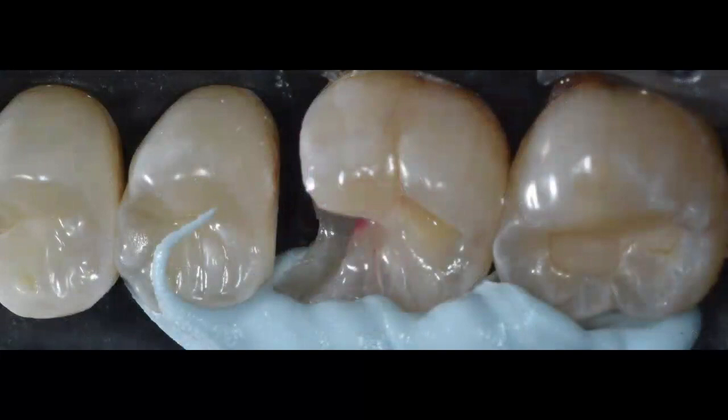I also identify where my peripheral seal zone is and how much decay I need to remove from that peripheral seal zone to accomplish the best bonding possible, and where I can leave some of that affected or even sometimes infected dentin near that axial wall, because I don't want to expose the pulp. I don't want to aggravate the nerve of this tooth. I want to stay away from those deeper areas, because these are the areas where I can compromise the vitality of this tooth.